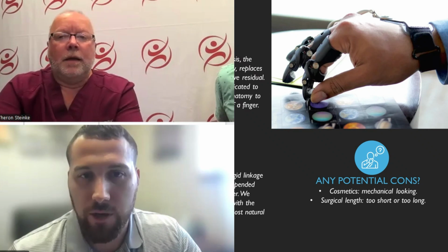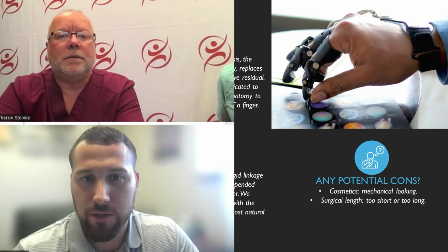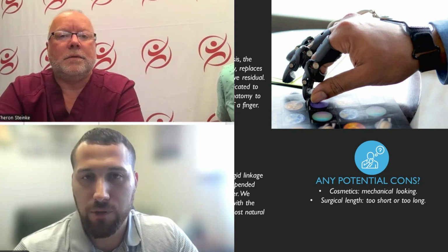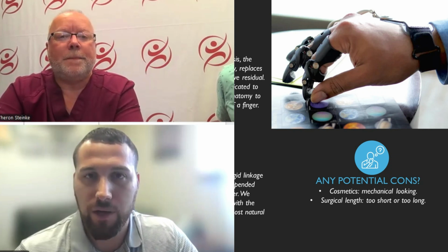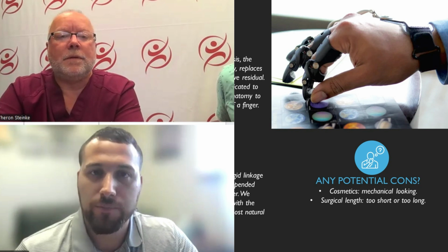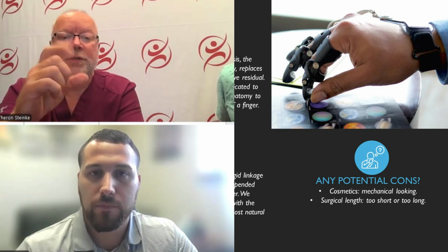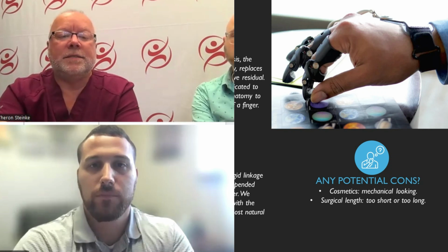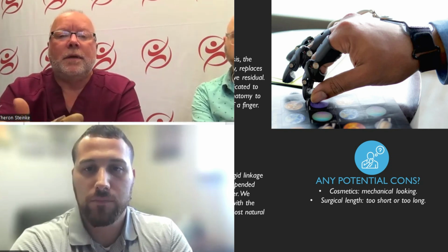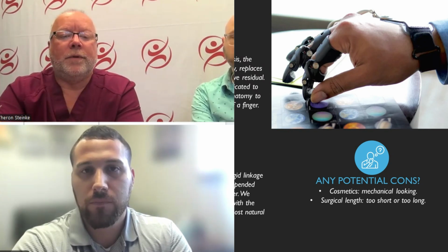So that is considered a body-powered or body-driven prosthesis, and it's very voluntary. So the user, the patient, has direct input in the outcome or the function of that device and the range of motion it goes through. Yeah, so the patient is really doing the exact same thing they were doing for flexion and extension on their finger. These devices are very strong. I don't know that we've had anybody break a PIP driver before.